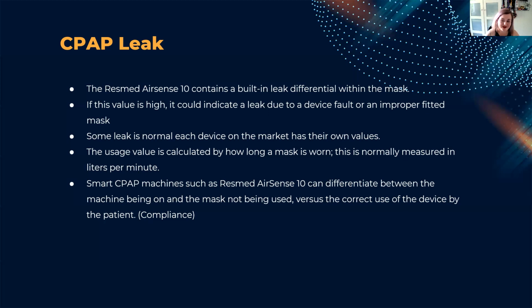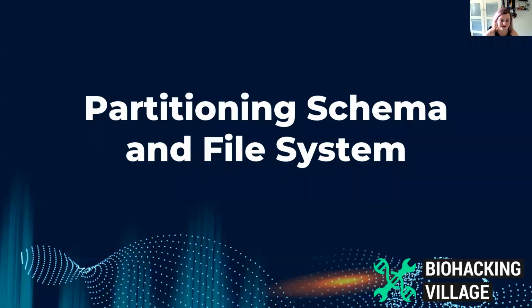Now, this is also how they use it. They use measurements for compliance purposes, to send it away to the physician to see whether or not the device is used adequately, properly, and correctly. So this is kind of how they monitor patients' usage of the device.